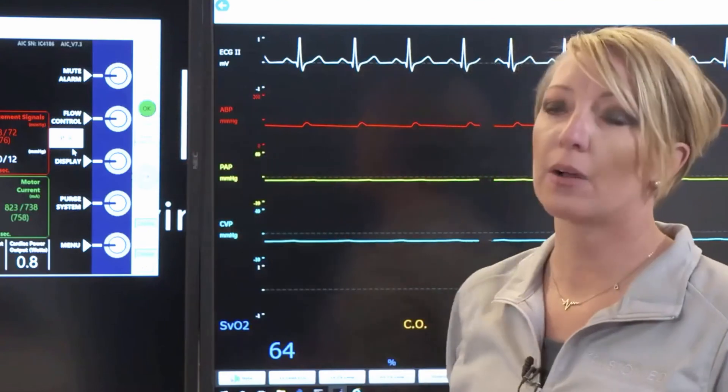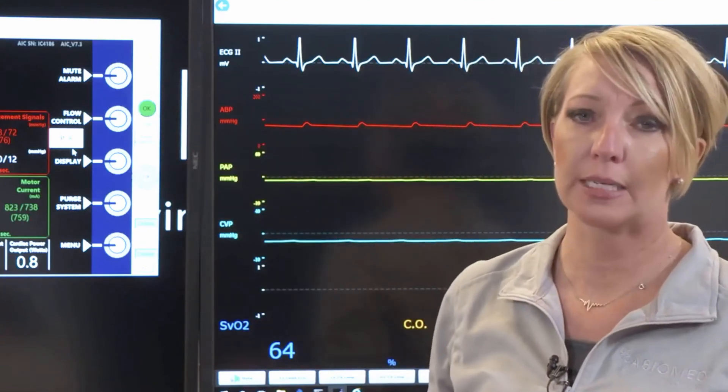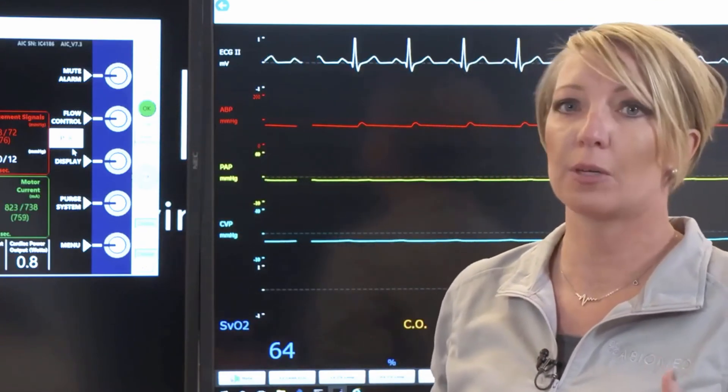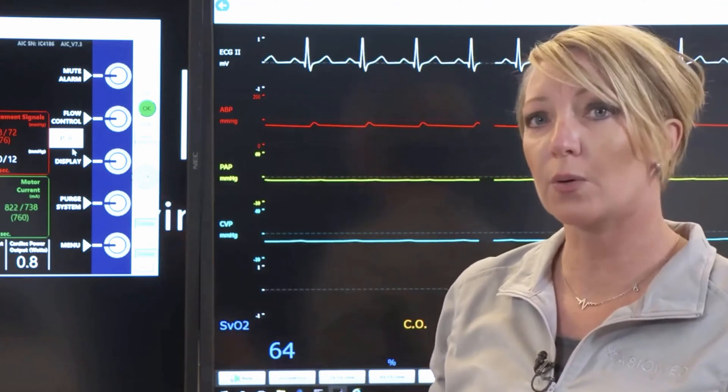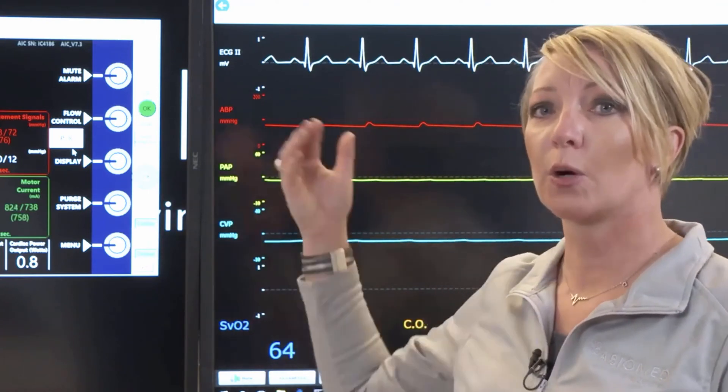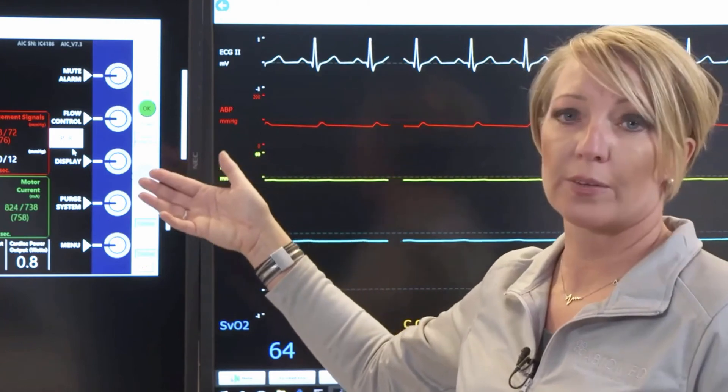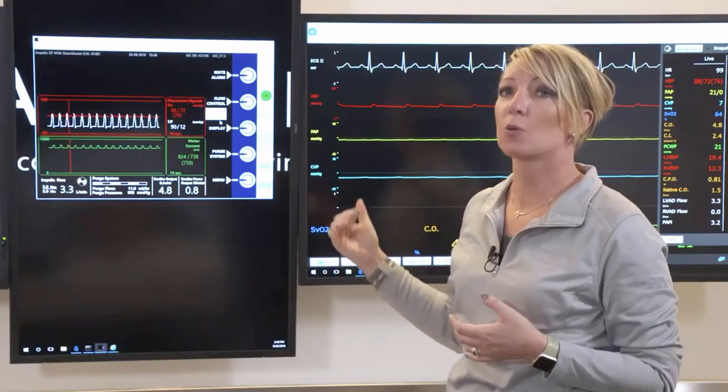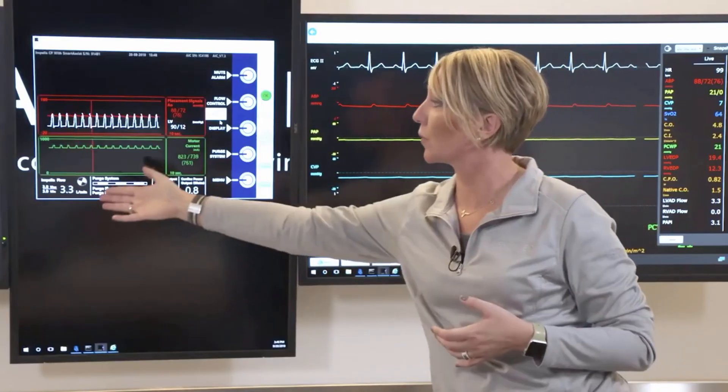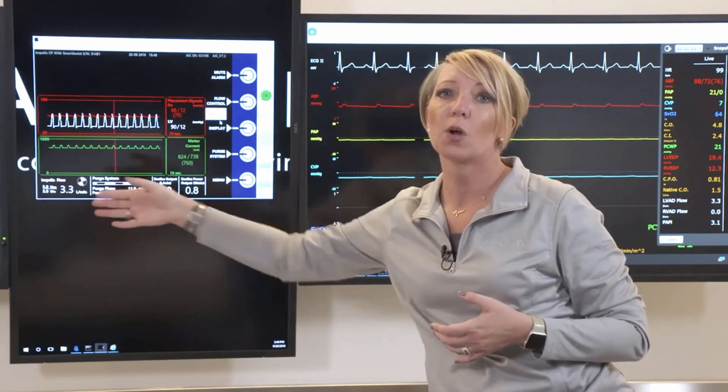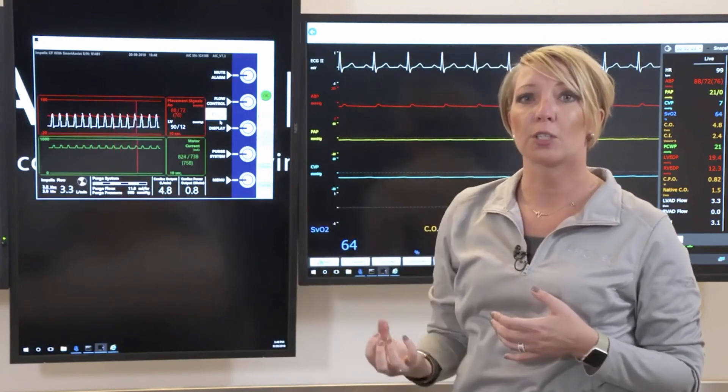The next button down is our flow control button. It does exactly what it says. Anytime you want to control the amount of flow that we're giving that patient, you're going to go into the flow control button. We run the device at different P levels. As you adjust those P levels, that will be reflected in the lower corner where you'll see that flow adjustment.